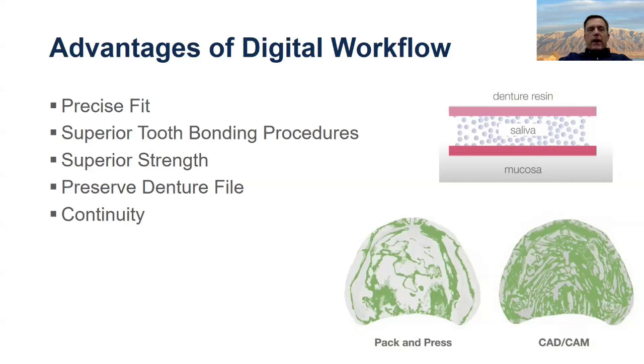You can preserve the manufacturing files. My recommendation for you would be to ask your laboratory and say, hey, can you send me the files that the denture was made from? Us labs, we generate lots and lots and lots of files every day. And so we often have to get rid of older files, or else we're not going to have the space that we need. Our computers run slower, et cetera, et cetera. So if you save it in your patient's digital file, then you'll have it for them.